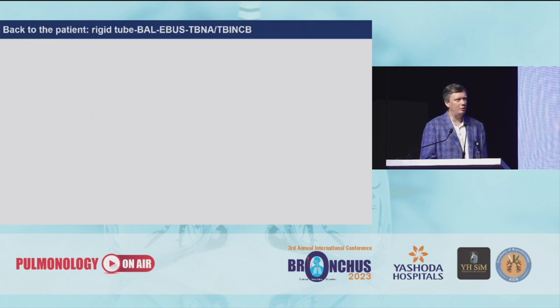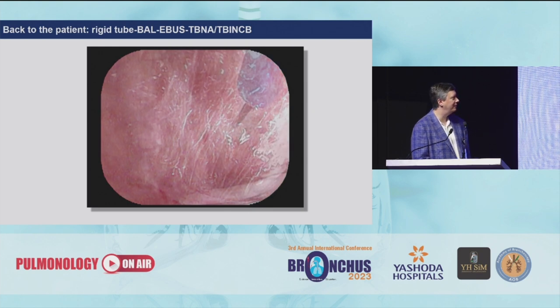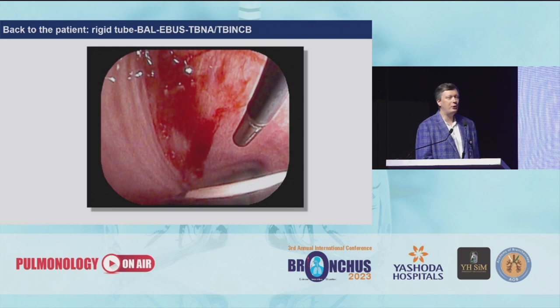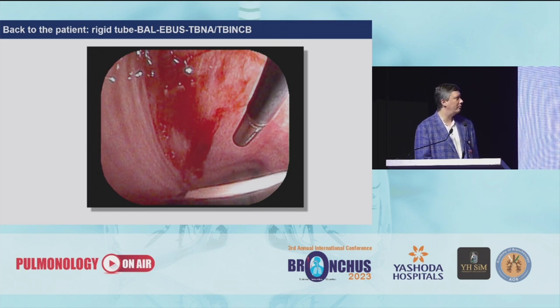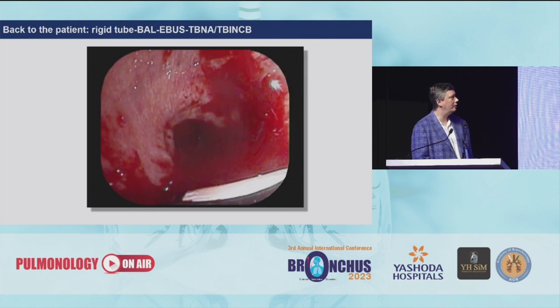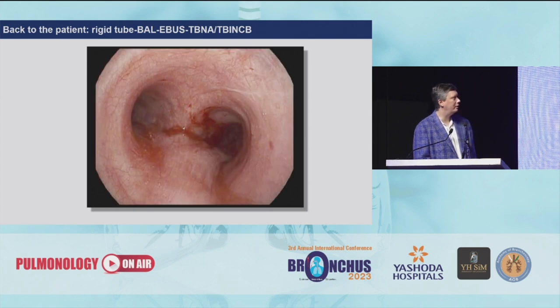Let's get back to our patient. We decided to perform a combined procedure. First, we made a bronchoalveolar lavage through the EBUS scope — it can be done, not often, but it can be done. Then we performed an EBUS TBNA using a coronal-shaped needle. And then we even made a transbronchial cryobiopsy in the subcarinal lymphatic node using a 1.1-millimeter probe from Erbe. We're finding the hole in the bronchial tree and sticking the 1.1 cryoprobe inside it.